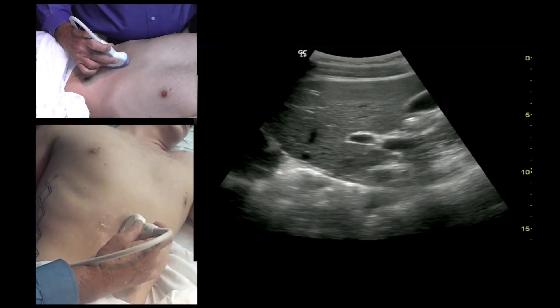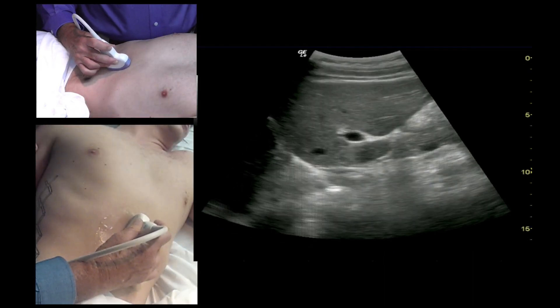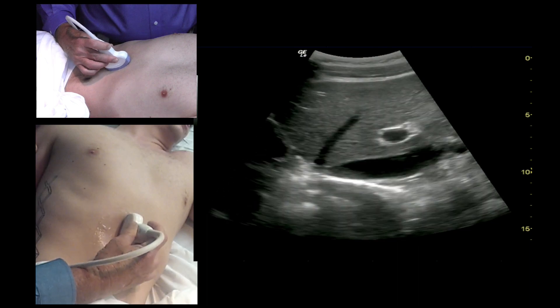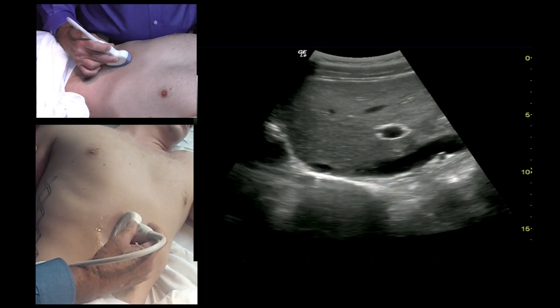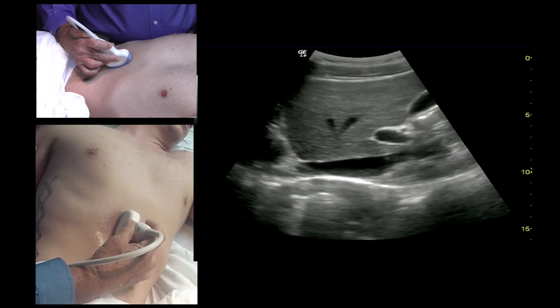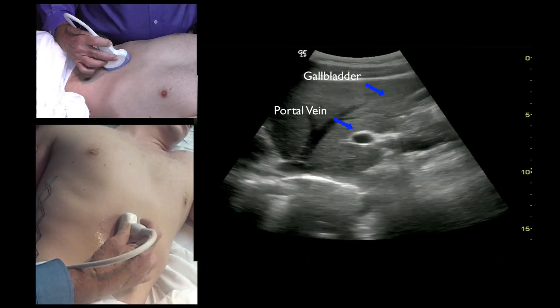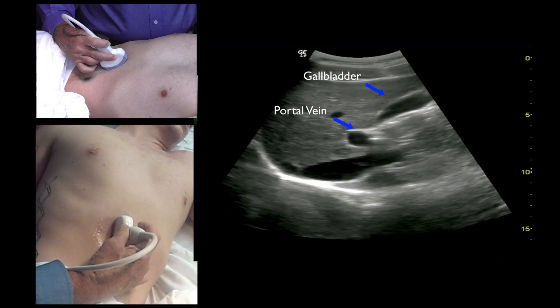If you're having trouble finding the gallbladder, scan until you find the portal vein, and then the gallbladder is just above the portal vein.